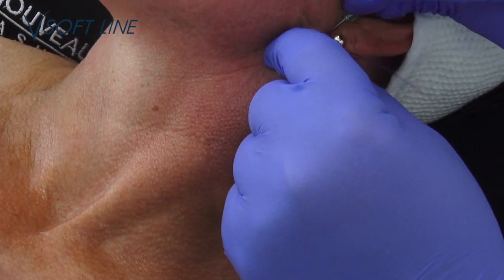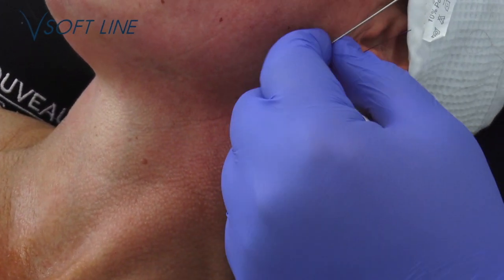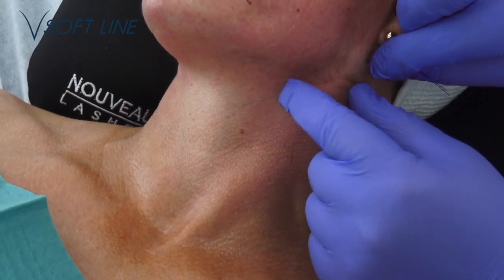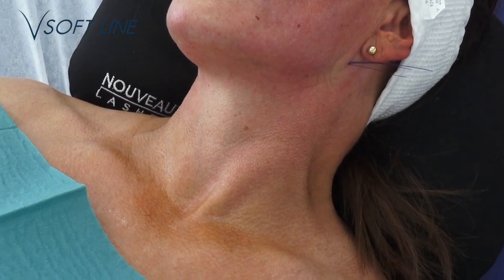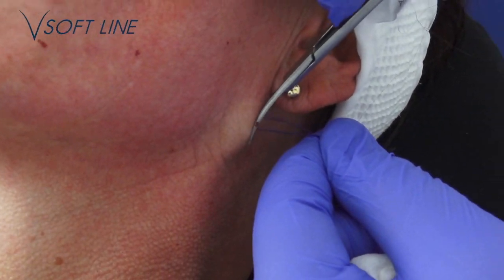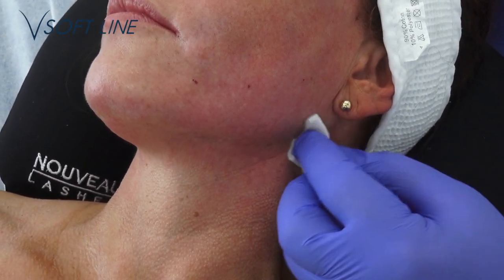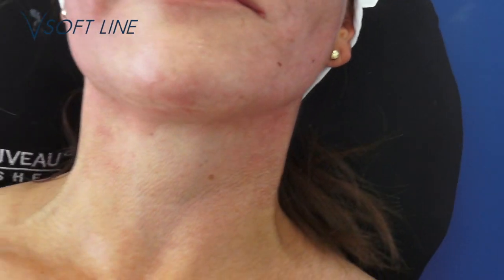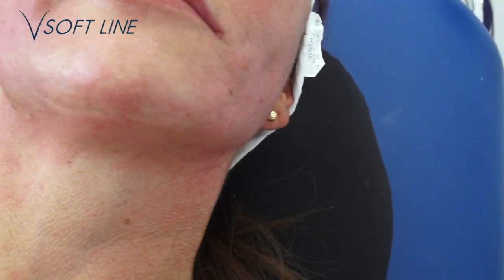Not too deep here. Good. And then you pull it out. And here we have the lifting effect of the last suture, and the effect from pulling all 3 simultaneously. And smooth out the skin to cover the entry hole. Look from the front. You see the shape of the cheek? It's just wow. Indeed, now the jawline is almost perfect.